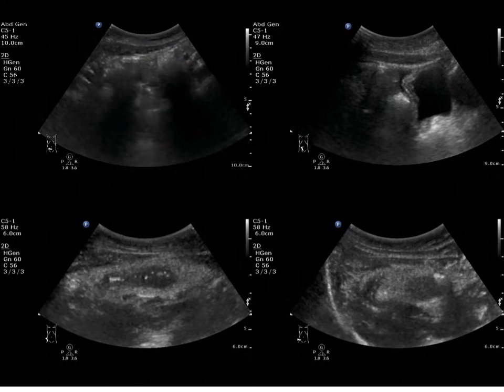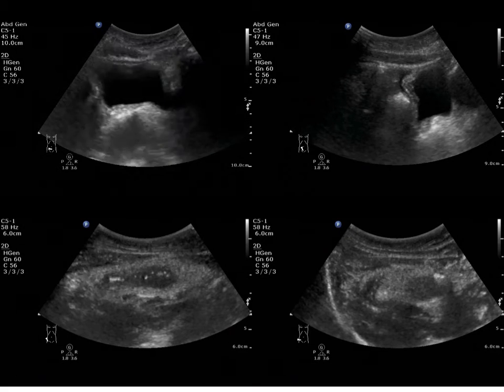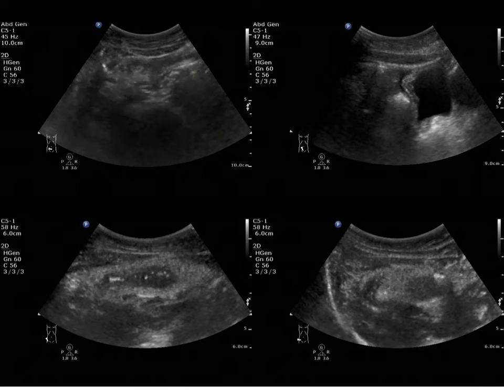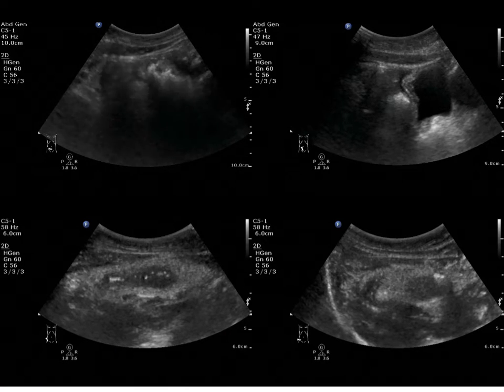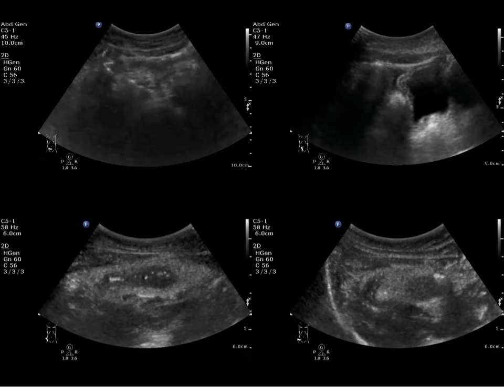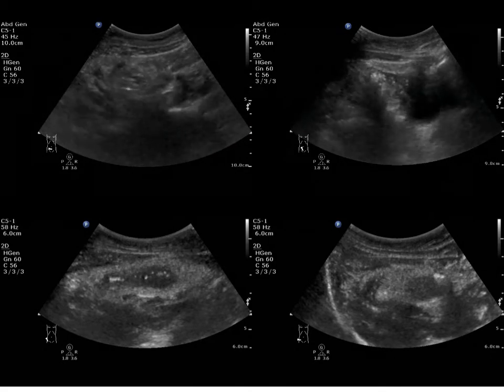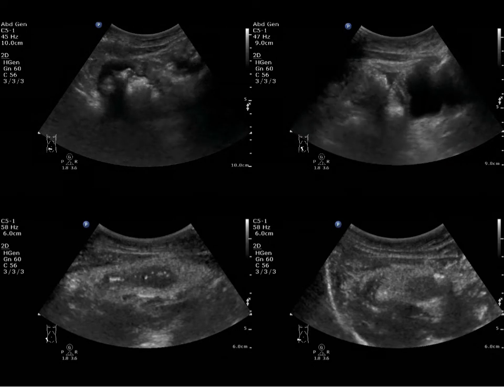What does ultrasound tell us about the patient's story? The patient developed dysuria. What caused the dysuria? It is the transverse scan of the bladder. Do you see the ascites? Ascites, right? Bladder, ascites, transversely, and then move sagittally. So that kind of fluid irritated the patient's bladder and caused the symptom. Where does the fluid come from?